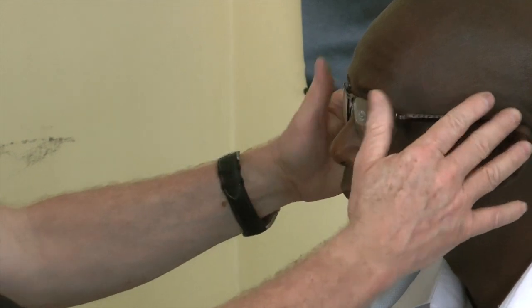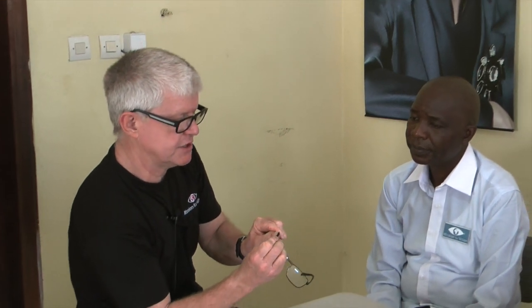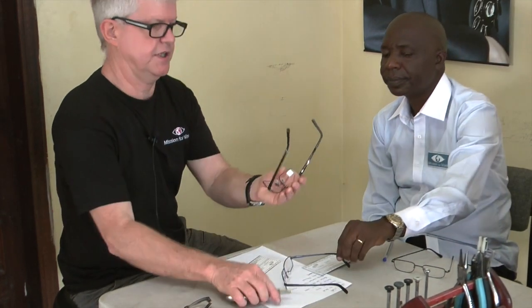If you look at me, Remy. We would normally heat using the frame heater, which is in the laboratory — hot air — which will make the plastic less likely to break. But because it's so warm today, I think we'll try it without and just bend it slightly. I'm going to get the head width right for Remy — remember he was 150 — so we place the frame on the ruler and set the sides so that they correspond to 150, with the sides nice and parallel.